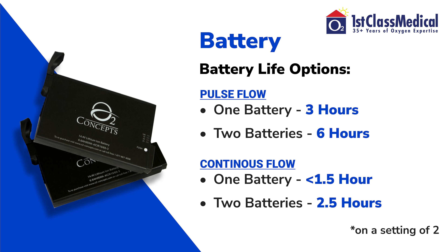When looking at battery life, on a continuous flow of two you're looking at about an hour and a half — a little less than an hour and a half for one battery. On two batteries, you're going to be at about two and a half to three hours of battery life. On pulse flow, per battery you're looking at three hours. So on a single battery you get three hours; on two batteries in the back of this unit you'll get up to six hours of battery life.